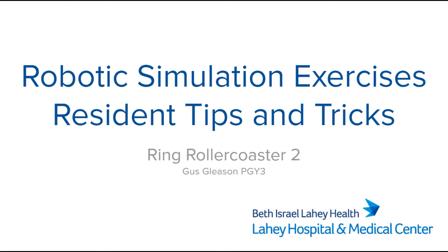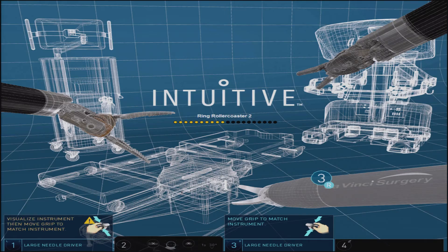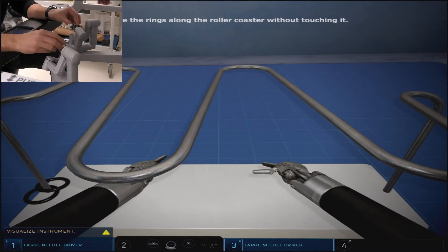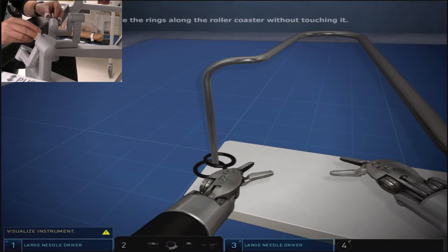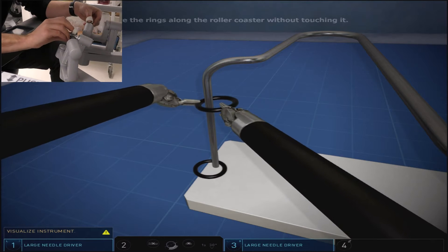Ring Roller Coaster 2 offers a more difficult iteration of the ring exercises. You are still moving two rings along the course of a metal pipe in the left to right orientation. However, this course mostly requires the rings to travel between pipes curving in the anterior to posterior orientation.